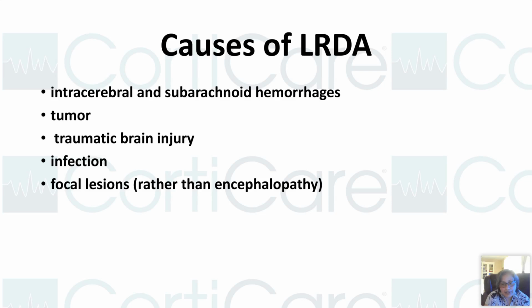The causes of LRDA are more or less the same as LPDs. So I don't have a detailed list here. Intracerebral or subarachnoid hemorrhage, tumor, traumatic brain injury, infection, or focal lesions. So it's not encephalopathy. Those are the focal lesions which cause LRDA.